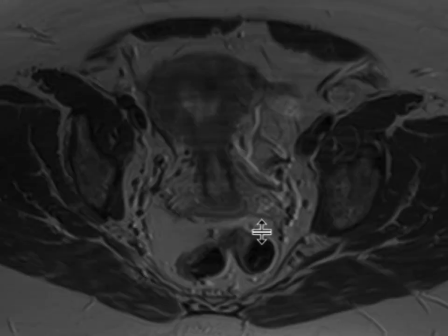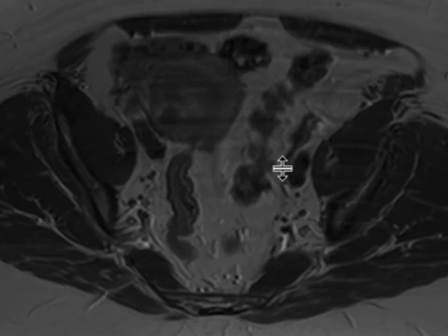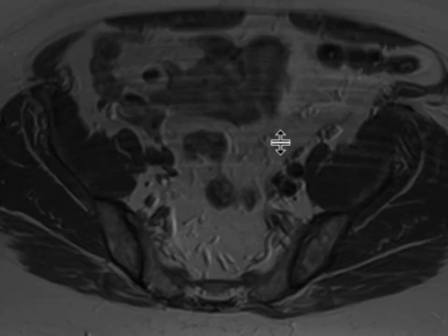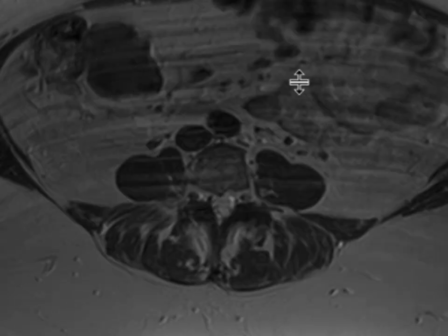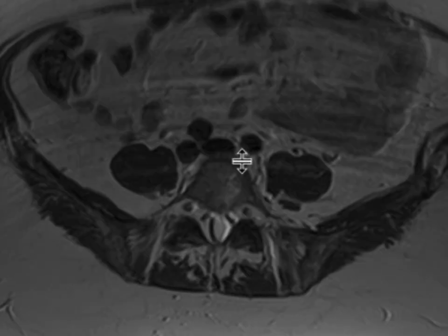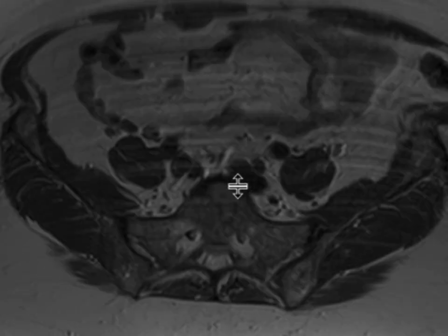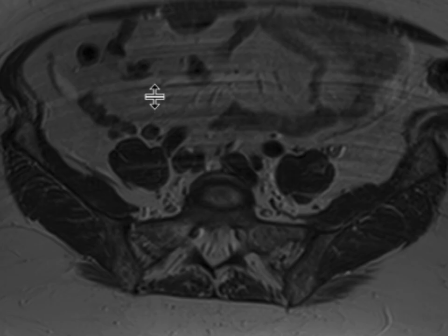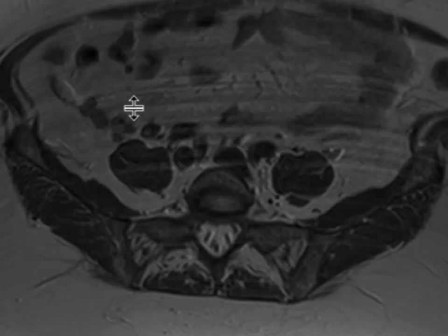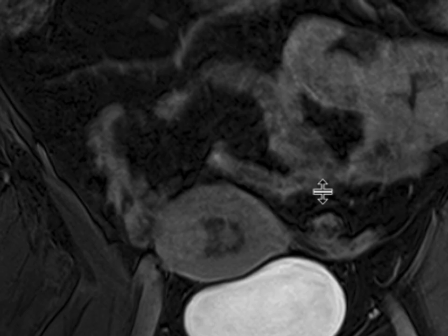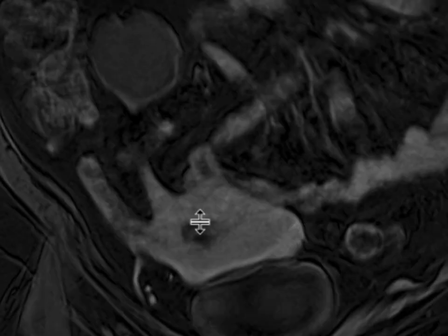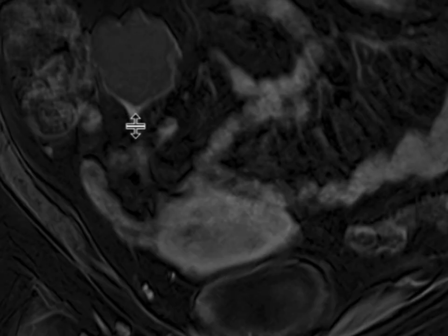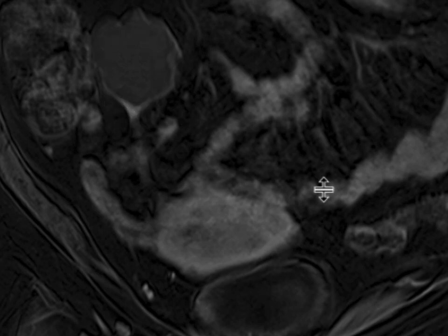There are additional fibroids within the uterus as well, and there's also this abnormal appearance of the endometrium, which we won't get into. In terms of the other mass in the right lower quadrant, we can see it right over here. It's T2 hypointense due to its calcifications, and we can actually see that it's attached to the uterus via this very thin stalk. There's a T2 hypointense stalk coming out from the right uterine fundus, sneaking in between some loops of bowel, going right to this lesion. We can see this nicely on the post-contrast sequences as well — this enhancing stalk going cephalad and really terminating in this right lower quadrant mass.